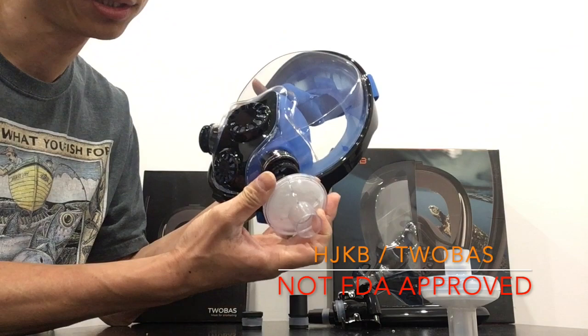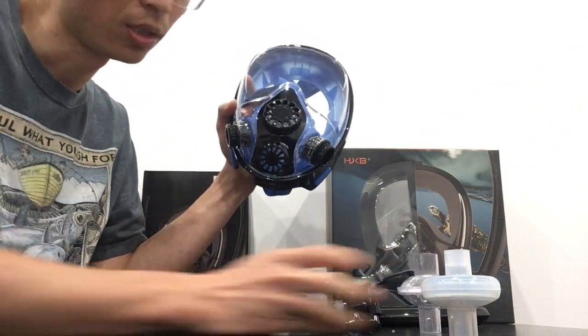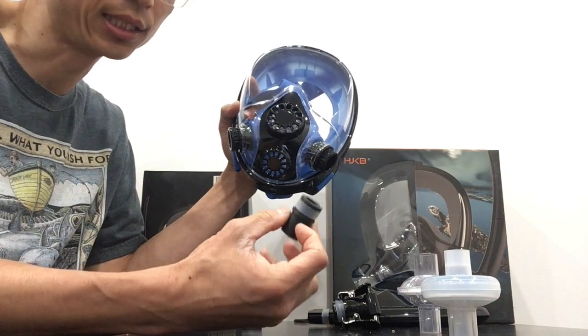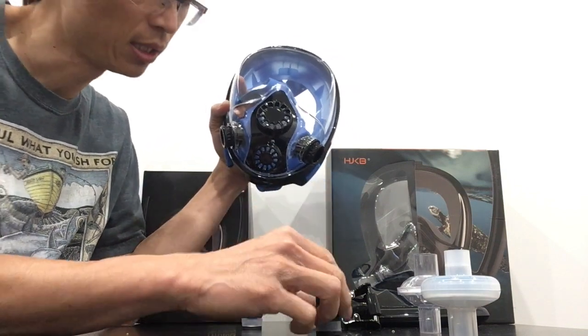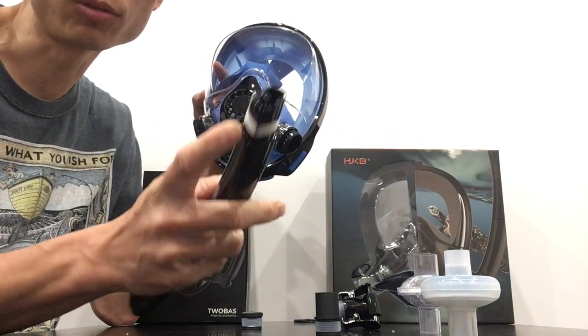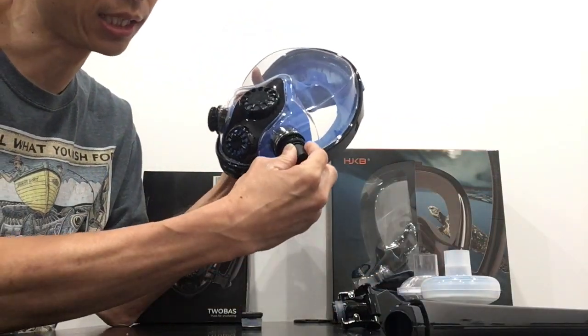However, some of the harder plastic ones will not directly fit into the mask. One solution is to take an adapter that we have on Thingiverse — you can take the O-ring off of the snorkel right here, place it onto the adapter, and you can get a nice seal.